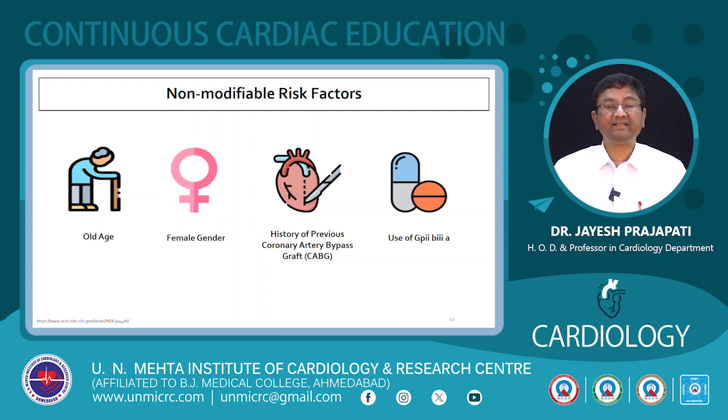And history of previous CABG, always when we treat the graft lesions, we have to see for the perforation, because the graft perforation there is no pericardium. So sometimes collection can occur to mediastinum or the pleura. So while treating with the grafts, we have to be very careful.